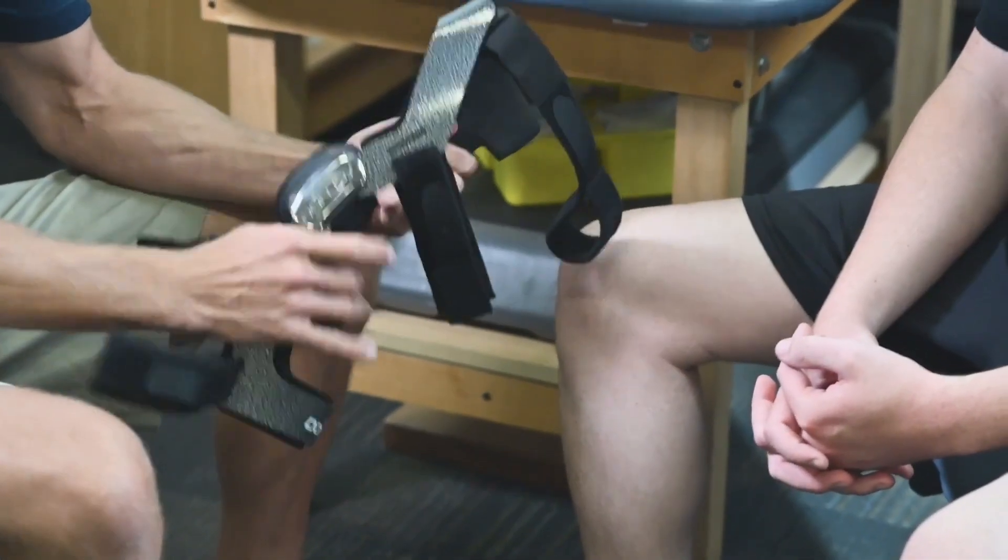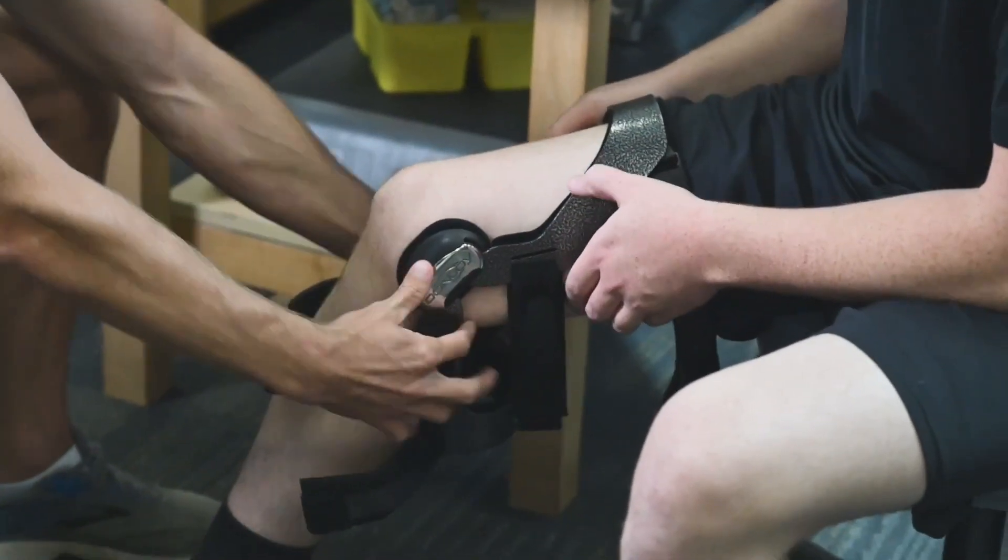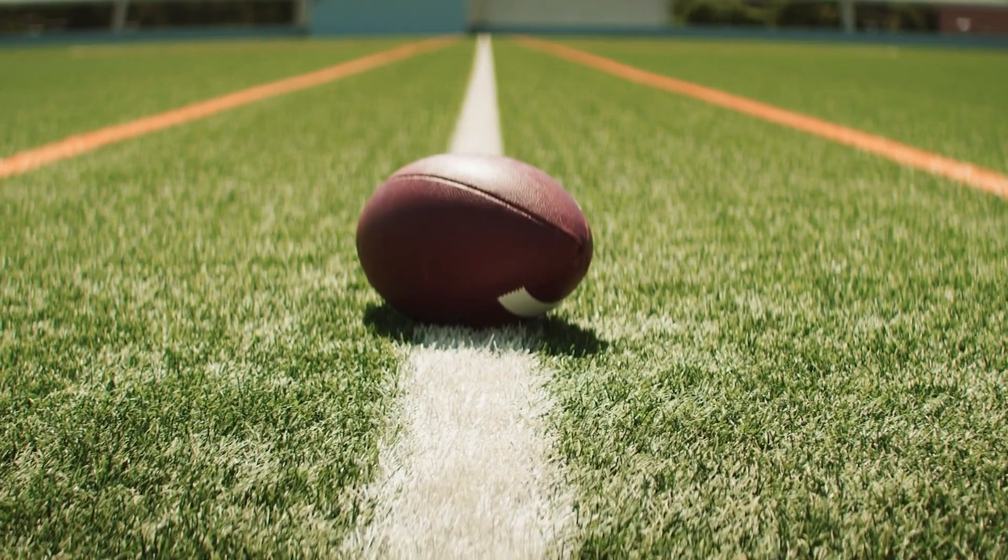My thoughts on prophylactic bracing are that it's very valuable to what we do as athletic trainers. I think it kind of gets us through the long term. The injuries that have been prevented with these braces, I think by and large would definitely be the MCL and the lateral collateral ligaments.